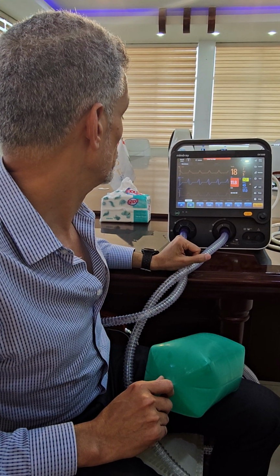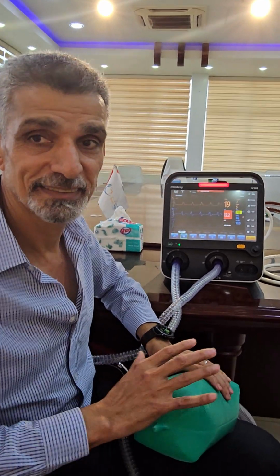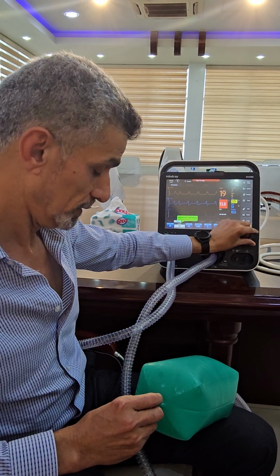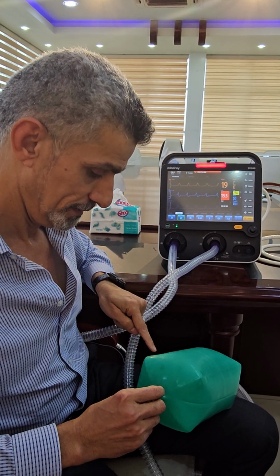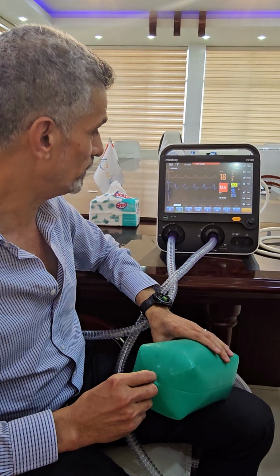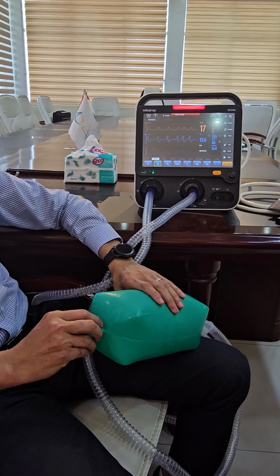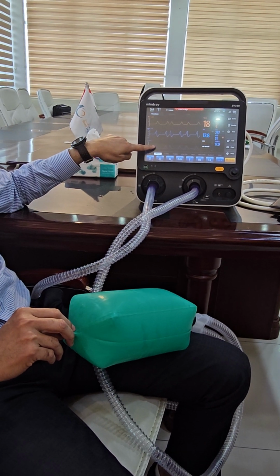See what happened now. It becomes faster to achieve the pressure. You see? Look at it. When we go less, it becomes slower. See? It was very fast. Now it's become less, because the faster you give, the more pressure; the slower you give, the less pressure. Okay? So now you know the graphics, and you can see the volume here.